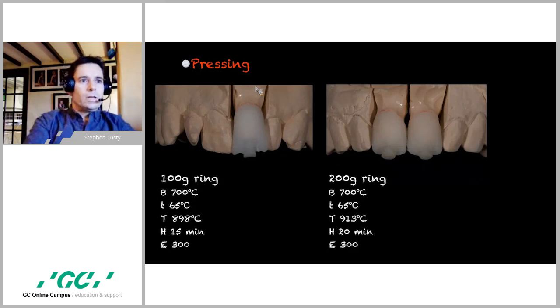So I use an EP5000 furnace for my pressings, and these are my settings. I started with settings according to the manual, but through seeing loads of posts on Facebook, I've tweaked my own settings until I was satisfied with the results. A calibration using Toshio Morimoto's method has confirmed these settings for me. Now, if you use an EP5000, you can take these settings and try them in your own furnace. I'm not guaranteeing they are going to be correct for you, because even furnaces of the same make would vary in calibration. So you may need to change temperature up or down by a few degrees.